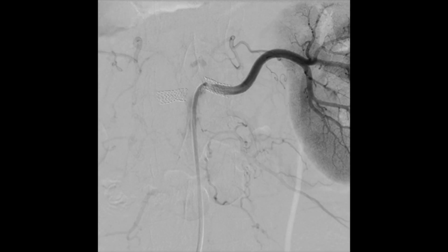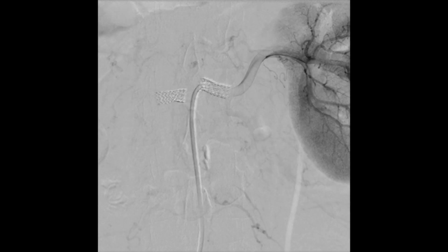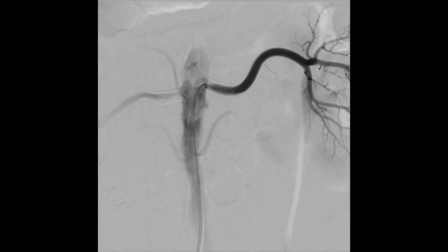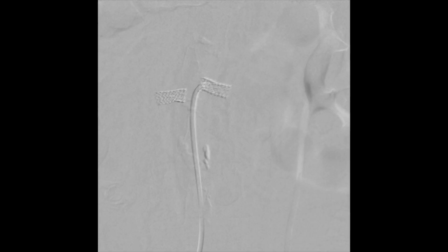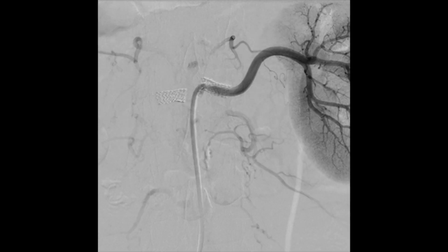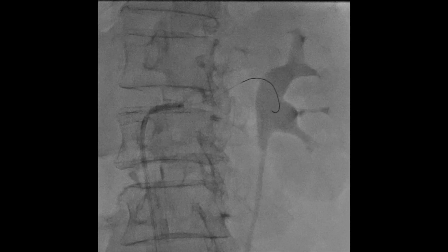At that time, we had some limitation of existing inventory. The largest cutting balloon that was available was 3 millimeter by 15 millimeter Wolverine. The largest drug coated balloon available was 3.5 millimeter Sequent Please Neo, and the largest non-compliant balloon available was a 5 by 20 millimeter NC track. So we had a lot of limitation with diameters of the devices. So in this patient, we took the femoral approach with 6 French JR 3.5 guide catheter.